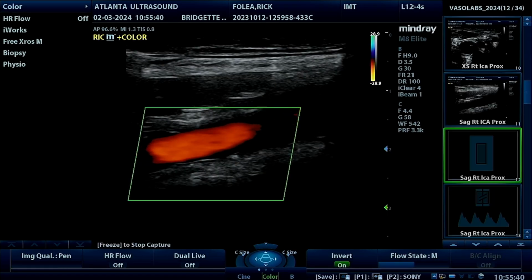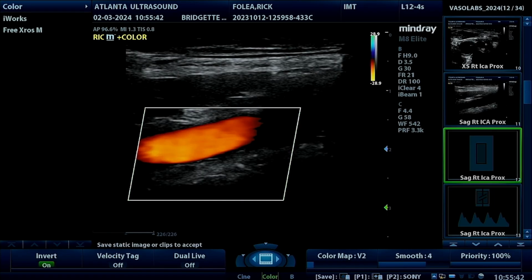We'll also turn on the color flow to see if there's any soft plaque hidden from our view. We see a nice full flow across the entire ICA artery, so that's good news. We have free blood flow directly into the brain. Cool. Now this is especially important because we tend to lose visualization this far up the neck, and it's harder to focus a sensor on tiny details because the sensor bumps into the jaw. Again, the colors tell you how the sensor's angled.